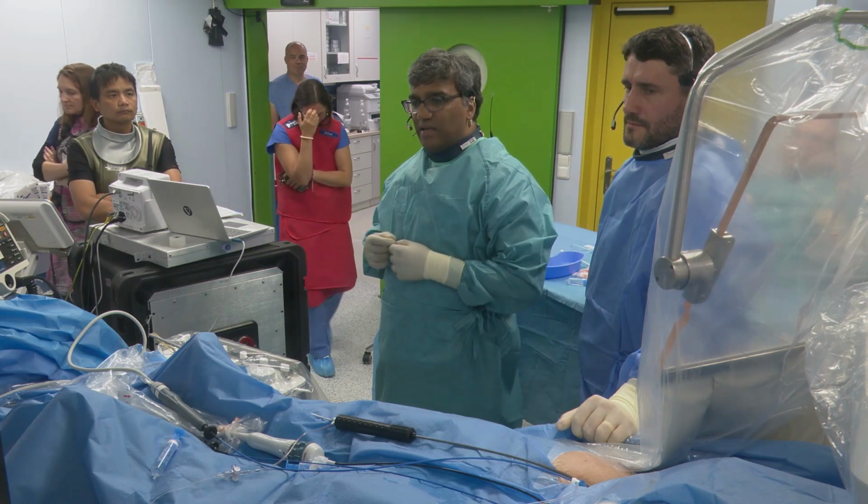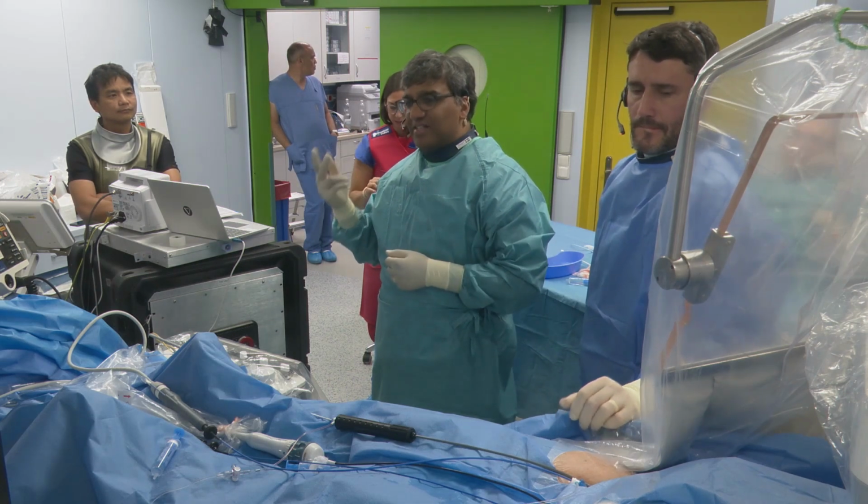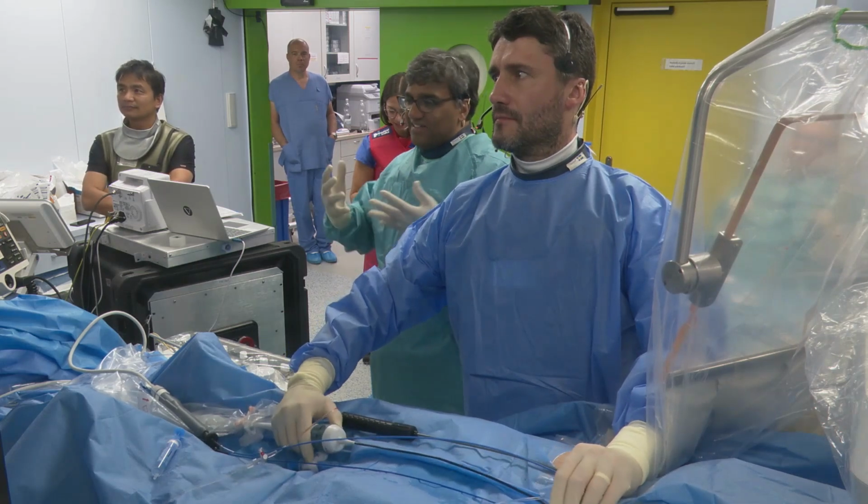We do it this close together for 2 reasons. 1, just to be safe. And 2, because that's the biggest red dot you can make on Carto. You can't make a bigger one. So that's the one we use.